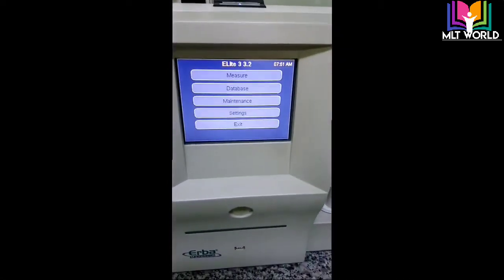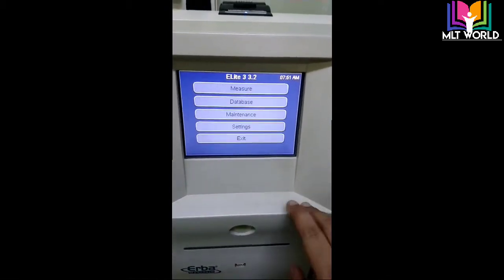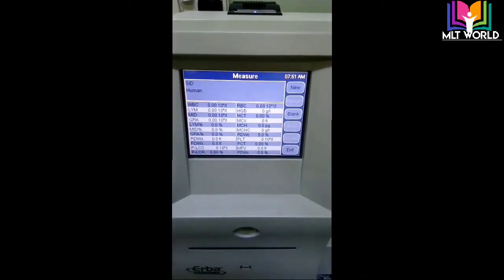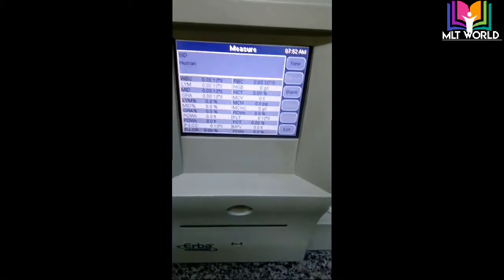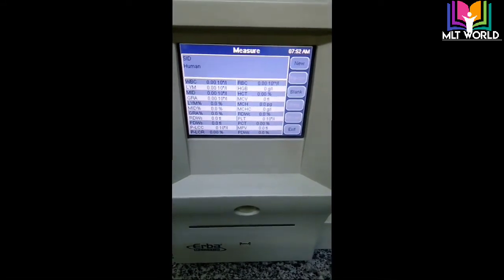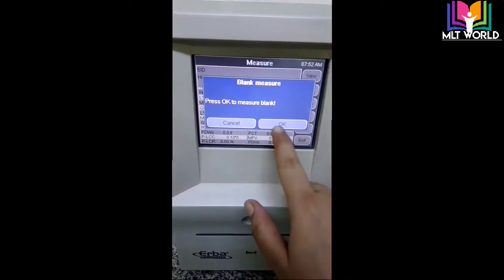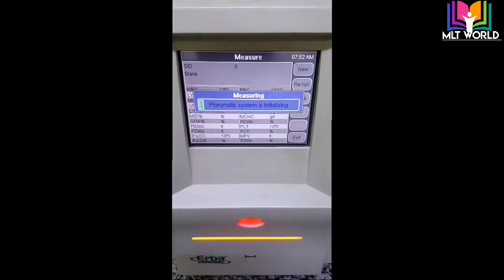Now you can see it has come to the main screen. First I will click on the blank — we have to run the blank first. When I click blank, it will go to the initialization process, and after initialization it will automatically run the blank. We will get the blank result. It says 'press OK to measure blank', so I will click OK and the process will start.